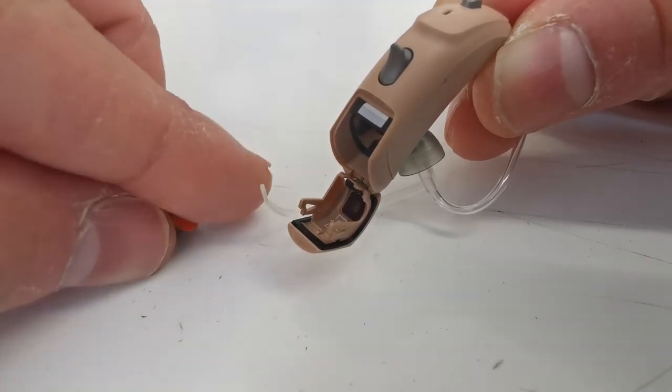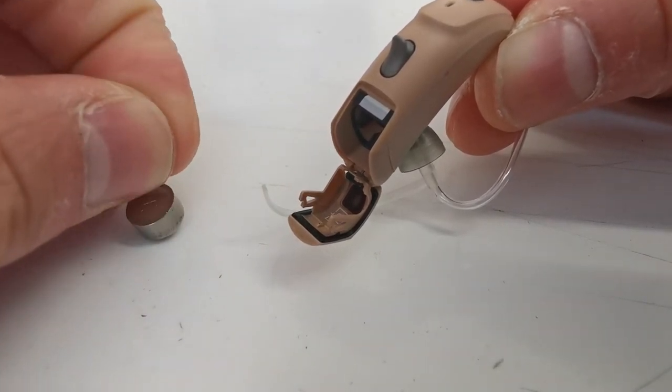You peel off the orange tab to reveal the positive side of the battery.